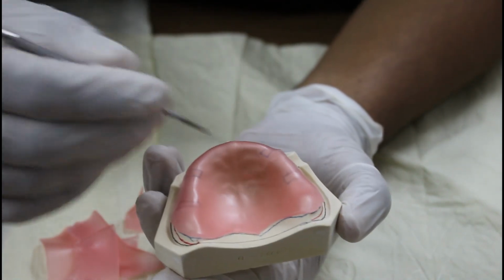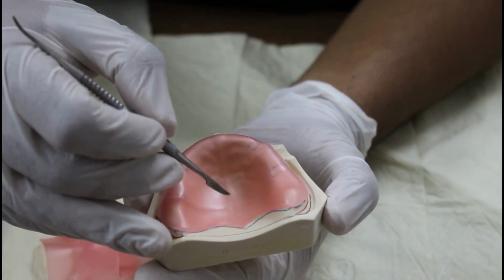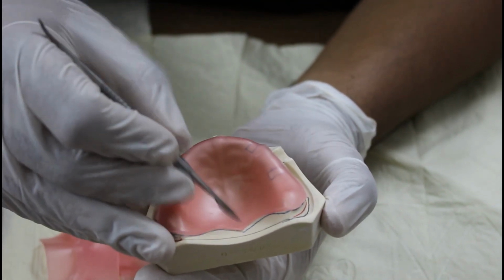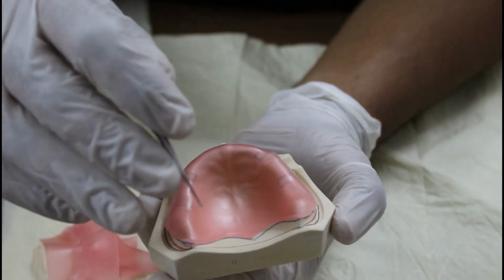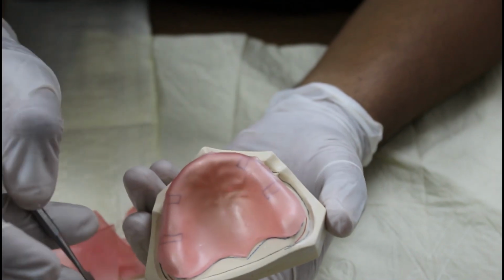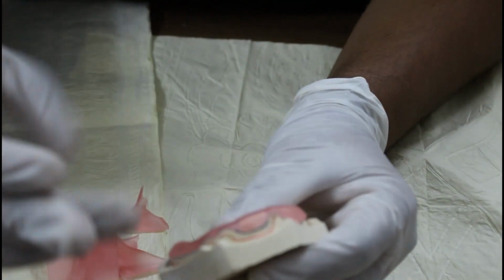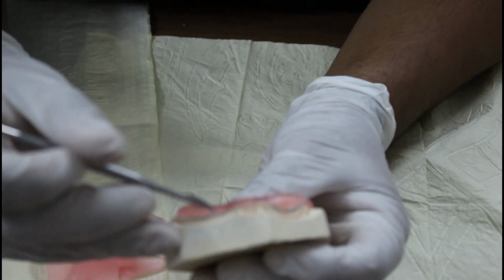There are different designs in which you put spacer only in the rugae and mid-palatal raphe, or you can put only in the mid-palatal raphe. We will not follow that at undergraduate level. We are teaching you a full spacer design. So this is the spacer. You can see it here. It is according to your blue color line.